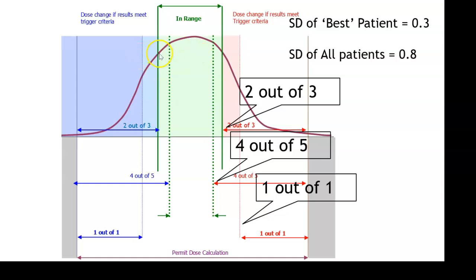If a result is low, however, but it's above that standard deviation lower limit, that 1.7, 1.8, so it's in this band here, that could just be down to chance. So what we need to do is say, well, has this happened before?